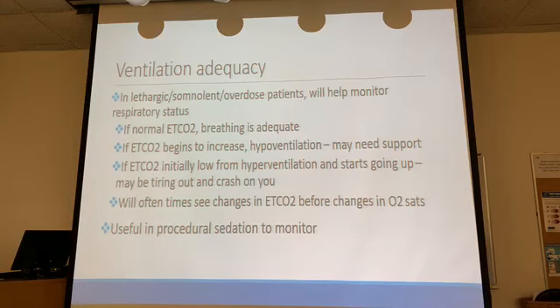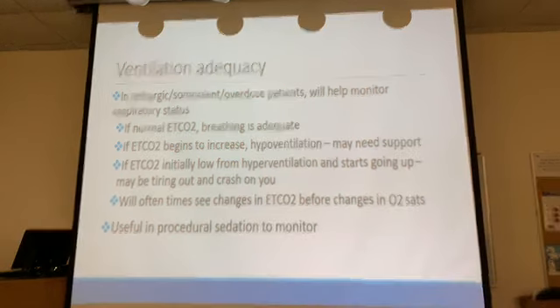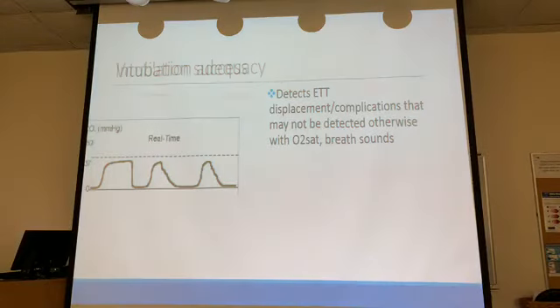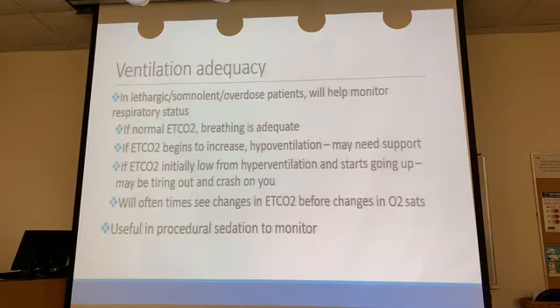You'll oftentimes see the end-tidal CO2 change before the O2 sat. And this is something that they use in the hospital. Of course, we don't be doing this, but it does apply sometimes to overdoses. We use it in procedural sedation to keep track of them, to know if they're breathing okay, if we're putting them in too deep or not. So keep that in mind, okay?